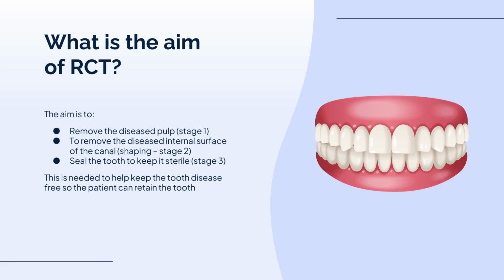What is the aim of root canal? The aim of root canal is to remove the diseased pulp, to remove the diseased internal surface of the tooth, and seal off the tooth to keep it sterile. Some dentists may refer to the various steps of root canal as stage 1, stage 2, stage 3. Stage 1 is you go in there and take the nerve out. Stage 2, you scrub the inside of the tooth and rinse it. Stage 3 is you seal the tooth so no more bacteria can get in.